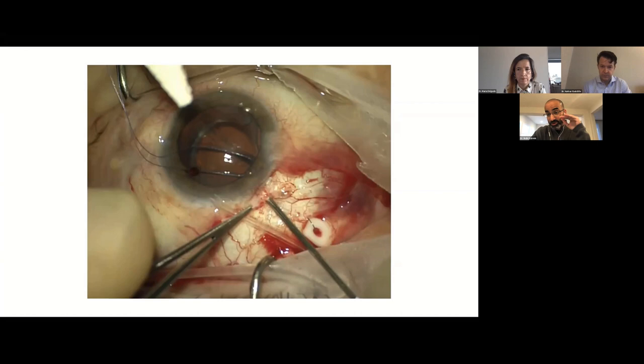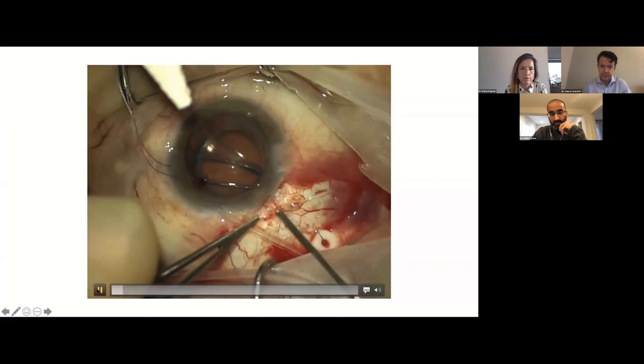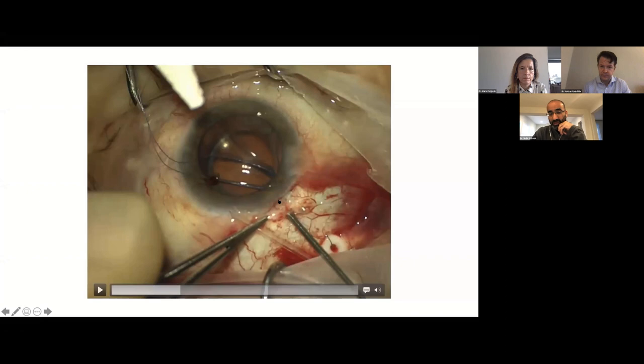So the way that we do it, and I'll just play this video here so you can see, when we're coming out, we actually side swipe. Do you see that right there? So I'm going to play this over again, and I'll try and pause it. So as the needle is coming out, the needle tip, so now you're completely inside of the tunnel, you're no longer in the anterior chamber, the tip of the needle swipes this way.